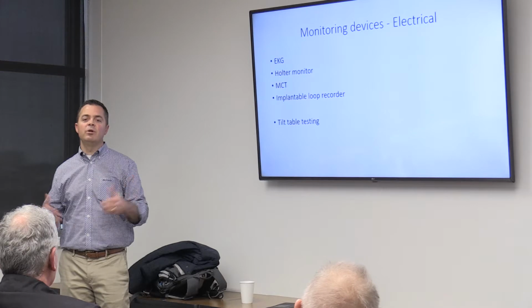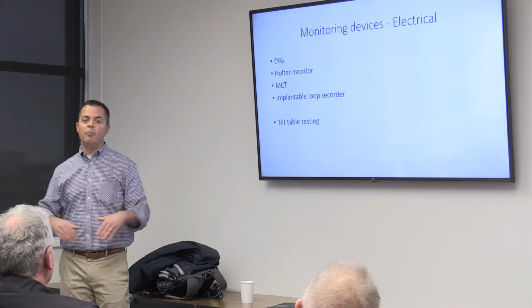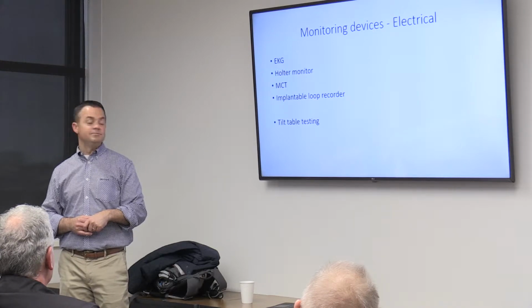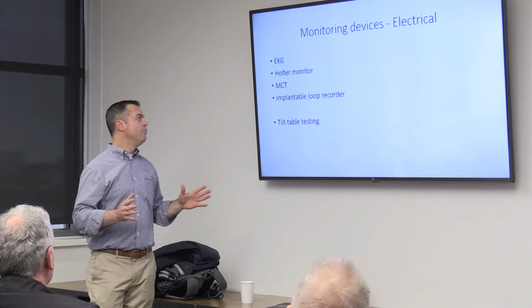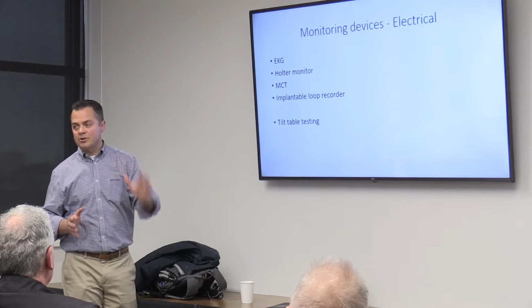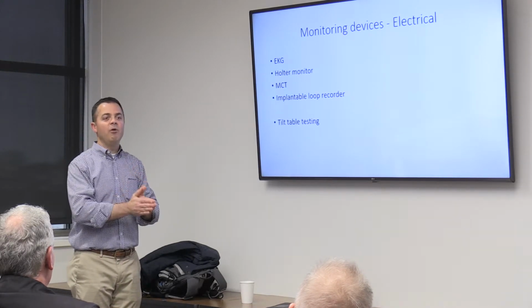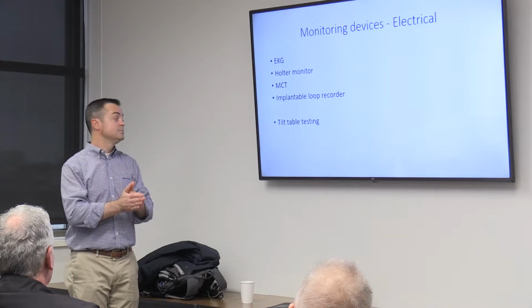And then finally we give them one of these, and we just say, come back when it happens, and they do. Monitoring devices are mostly for electrical diseases, but you want to pick the right monitoring device based on how often the patients have them.